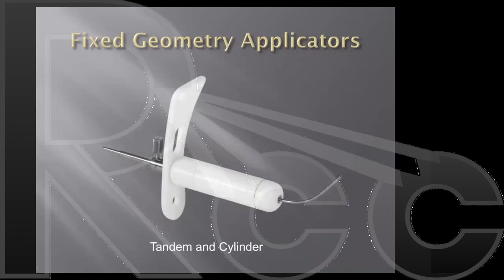And this is a tandem and cylinder applicator. There are some patients, which I'll get to in a few minutes, where we just can't get ovoids in. We can't get a ring in because they have such constricted anatomy, and this is perfect for those patients. You can set the tandem so that the flange is right up against the cervical os, and make sure that when you put it in, it goes all the way up.